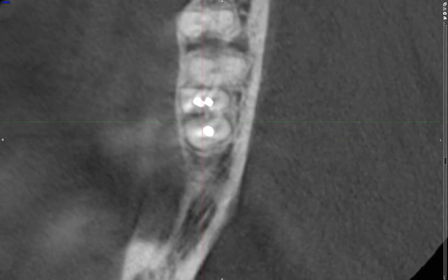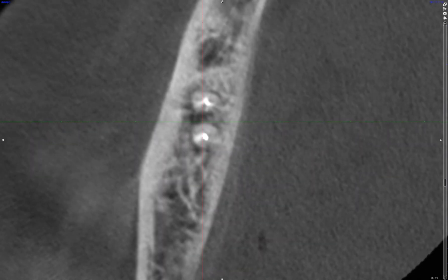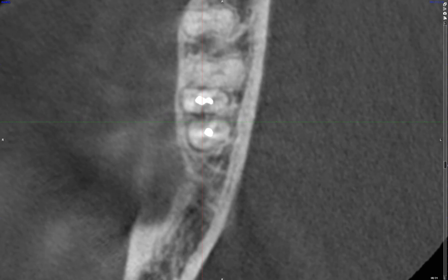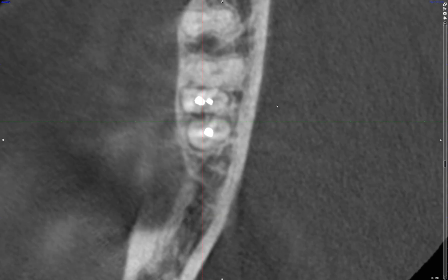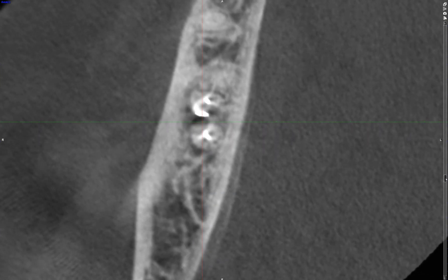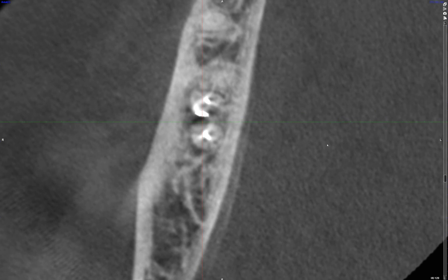Are you seeing anything interesting or unusual at this point? As you're following down the roots, you will notice that these filling materials actually merge with one another at about the mid-root level. And as we continue to go down toward the apex, we see a separate radiopacity along the distal border of the mesial root, perhaps located outside of the root surface.